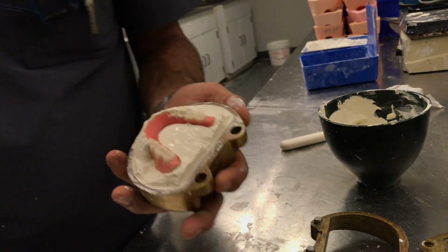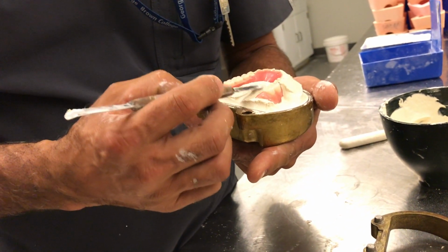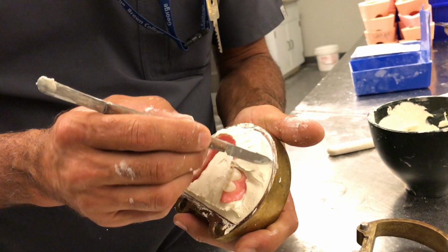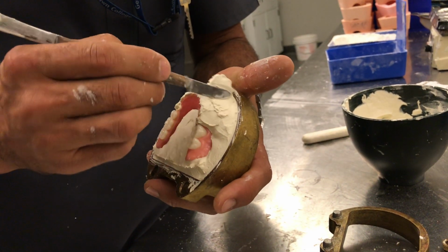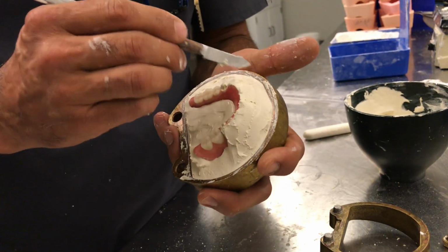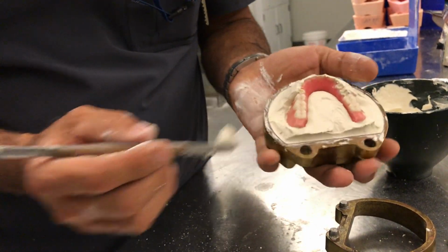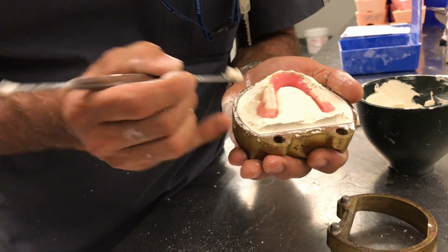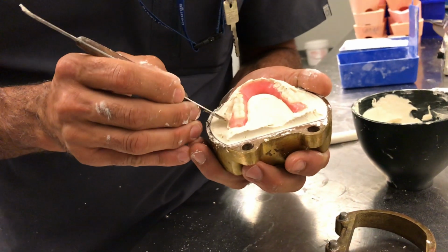Okay, so once I've exposed the outer edge of the flask, still getting a little air pocket trapped in there that's trying to come through. Go back and carve the excess away into a tapered finish to ensure that we don't create undercuts now through our investment. Careful with the tip of your instrument not to scratch your wax-up.